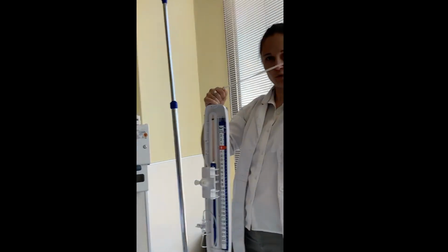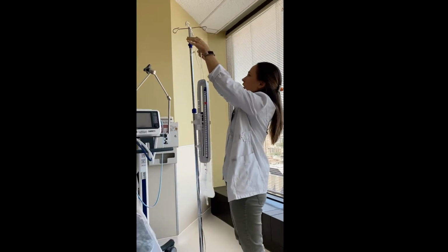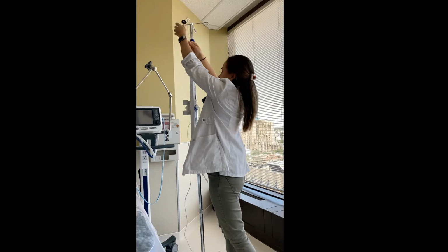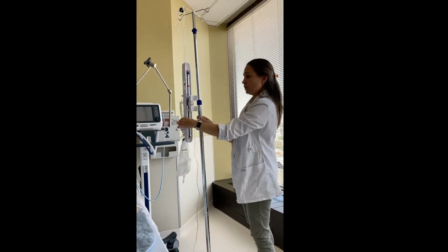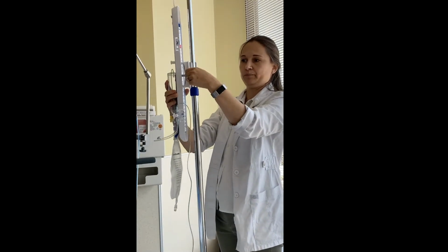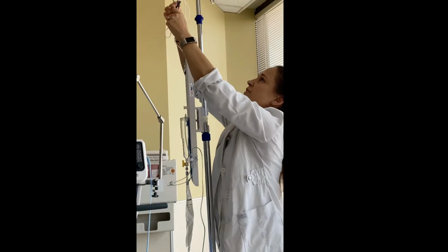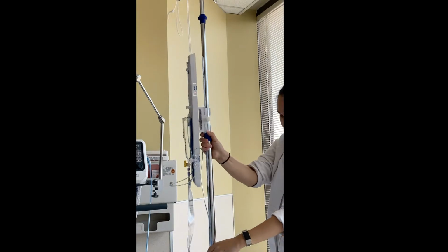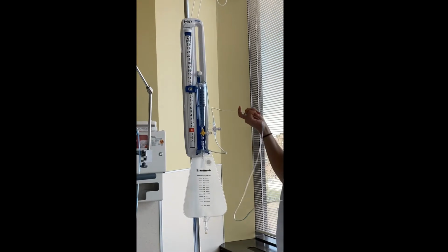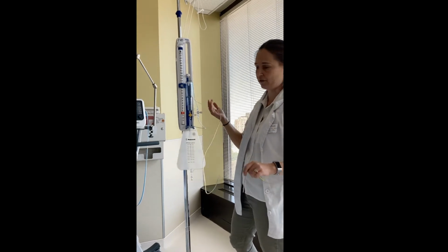And there's a button that you can push on it to adjust the height of the cord. So I can hang it up at any height that is prescribed by the neurosurgery team and readjust the cord like this. As a security mechanism, we also have a clip here, and I will also tighten the clip. So this way, my system is held up in two places, because what we don't want to happen is we don't want this to fall and disconnect from the patient, or we don't want this to fall and the CSF would start draining into the chamber because of the gravity.